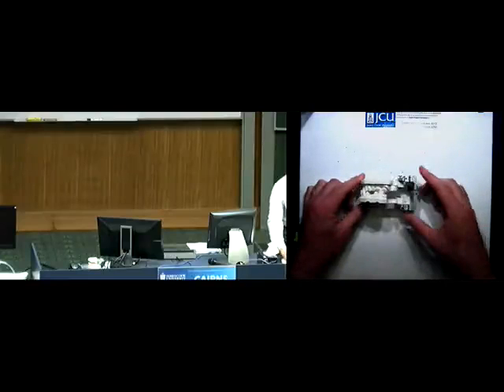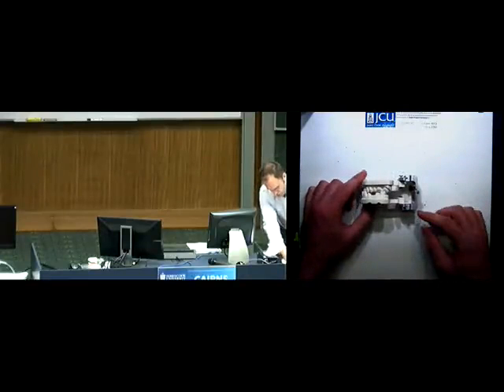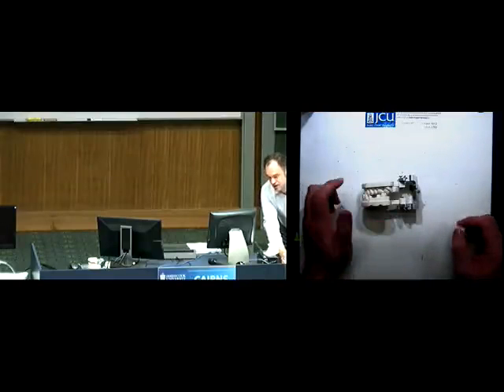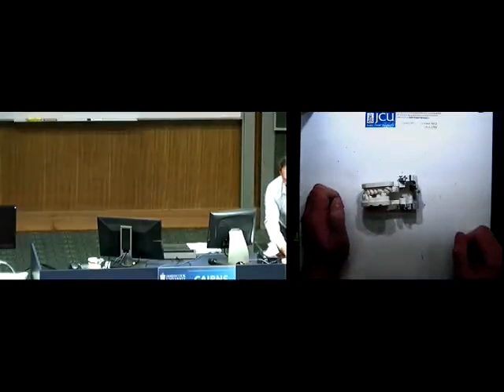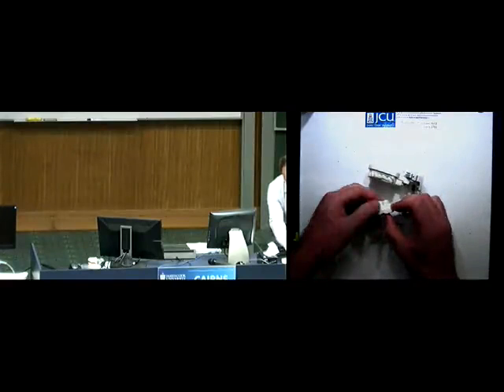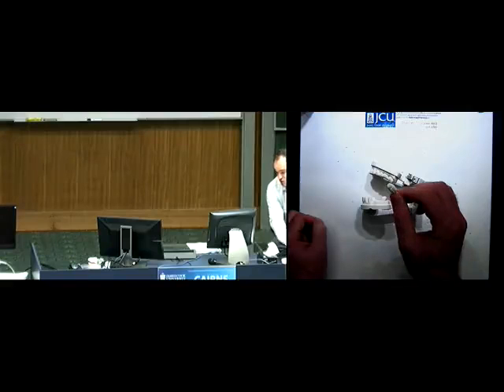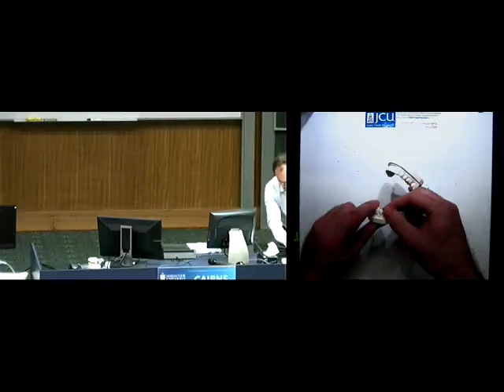So I don't know if you can see this, but if you look at this portion here, this is a reusable articulator, and the upper and lower get snapped into place. And because you've recorded the bite and centric, you're effectively telling the lab the occlusion, not the lab interpreting it using an articulator. It opens and closes, obviously, and these dies are removable, so I can take these out. And I'm not sure how well you can see that, but the ditch has been milled on a $250,000 machine, not a kid who's probably hung over earning $20 an hour. So the dies are incredibly accurate, and there's two here.